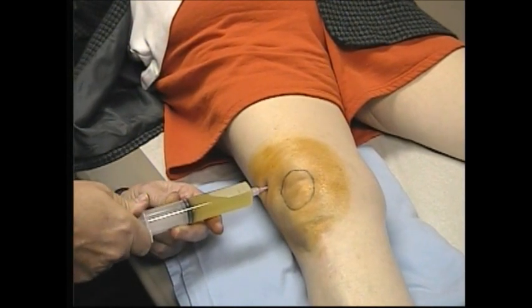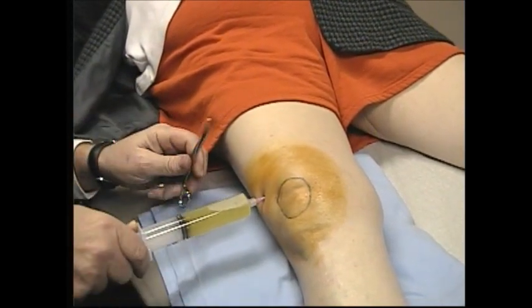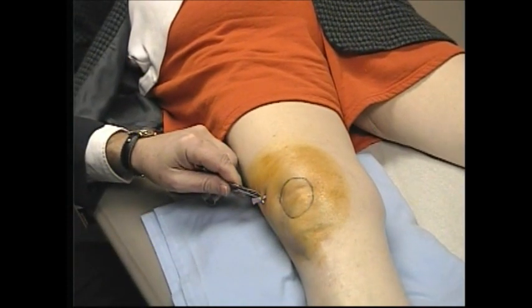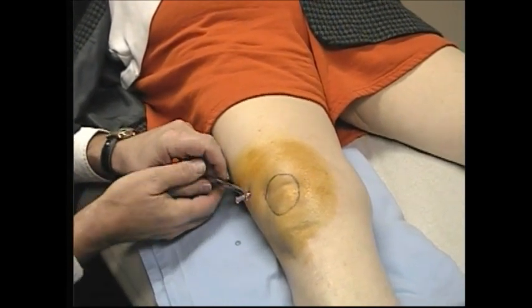Do you have a hemostat? I'll do that. There we go. Just to kind of show you, we'll change this. Go ahead and take — empty that, and then bring that back to me. You can see here's the fluid.